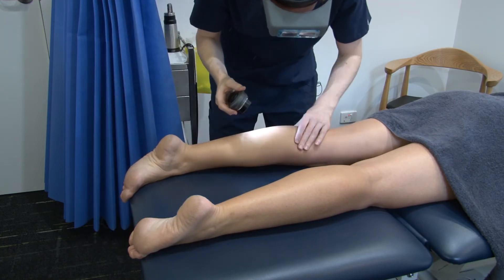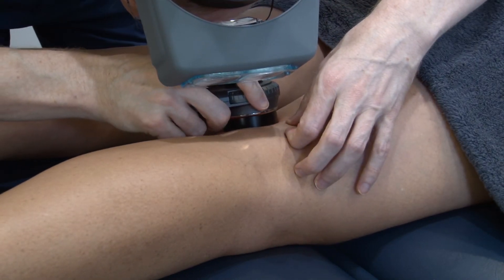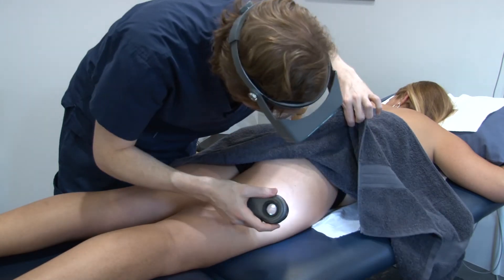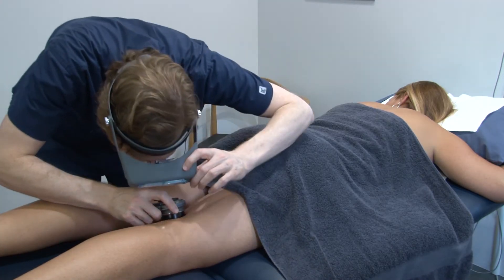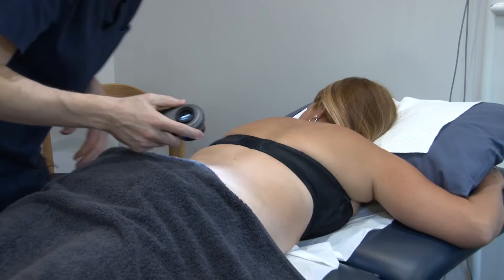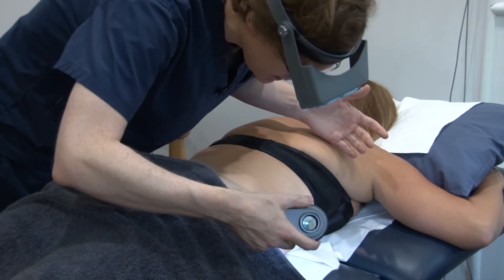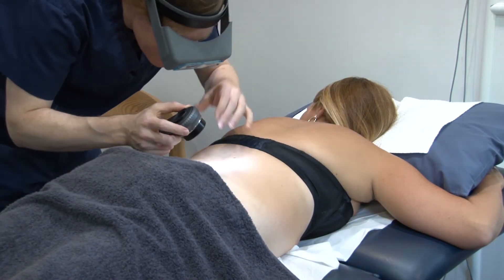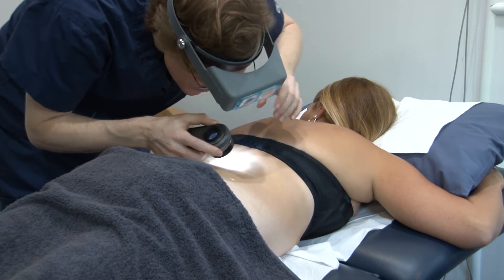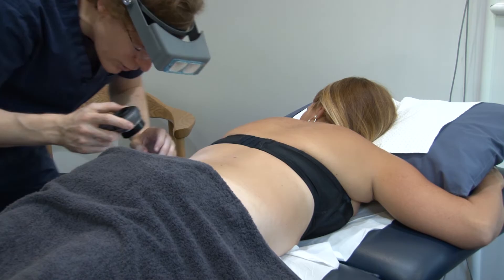Could you turn over on your tummy? Calves, back of thighs — doesn't take that long, really, to check the back of most people's calves or thighs. Then you get to the undies, and what I say is: can I have a one second look at the left cheek and a one second look at the right cheek. Often nothing there. Then go onto the back, make sure it's all looking normal. It's a very dark mole here, but it's very normal — it's got a nice reticular pattern that does not fill me with dread.